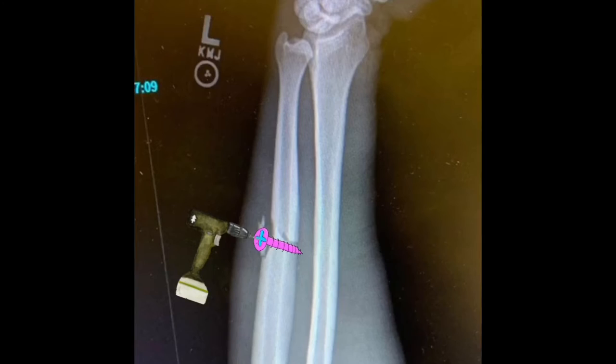I would take the proximal portion — the large piece — and apply it adjacent to the proximal ulna shaft and fix it there with a screw. Notice how our first screw went bone to bone and did not go through the plate. We call this a lag screw.